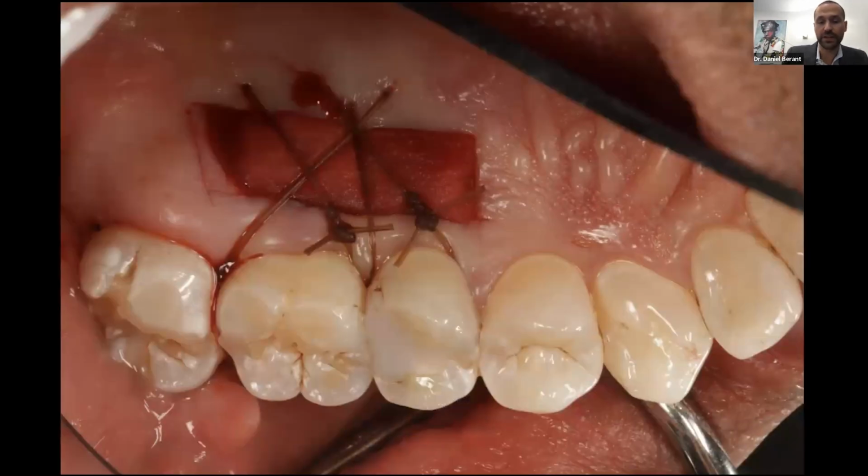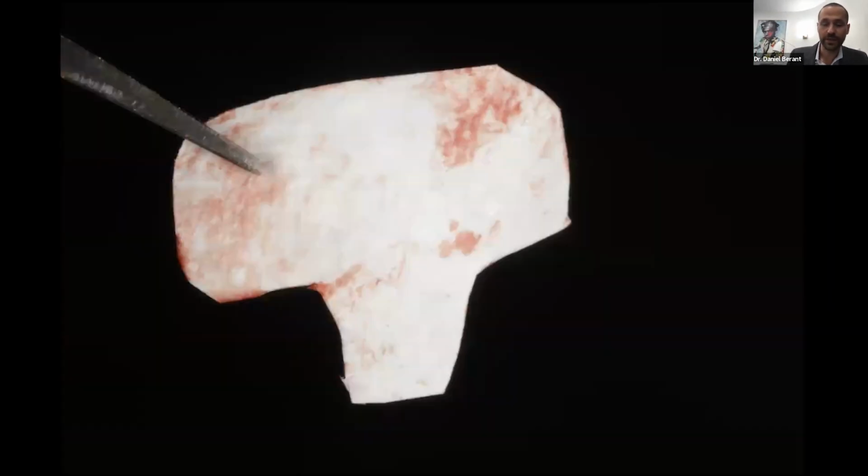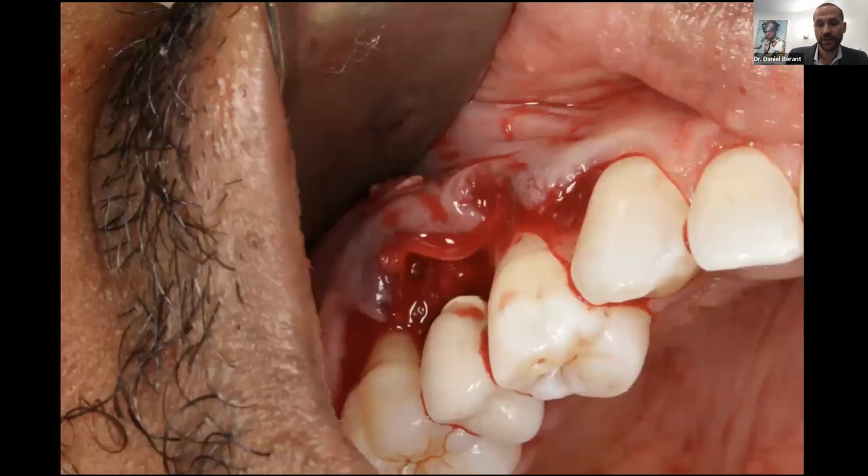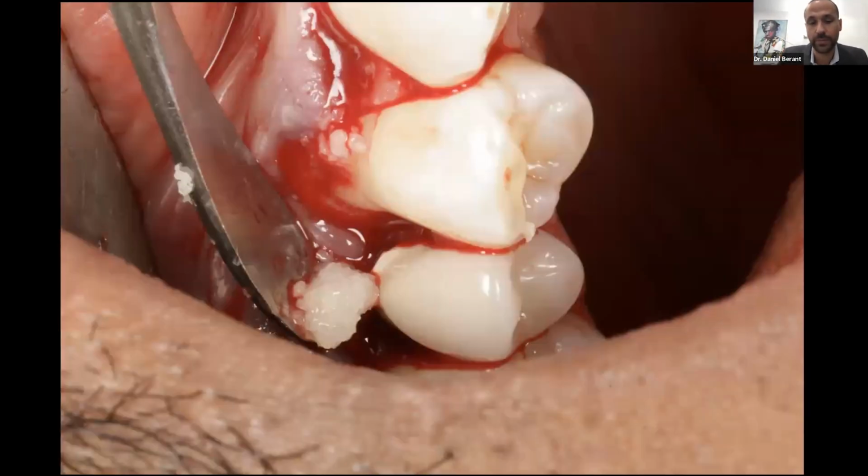Then I put collagen in the harvesting site, and then we do periacryl glue. And then on top of that, we provide our patients with a clear surgical stent. For this situation, I used a collagen membrane to help house the bone graft. And here you can see the collagen membrane is tucked into the flap, and we start placing freeze-dried bone allograft.